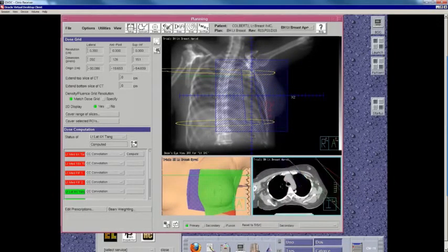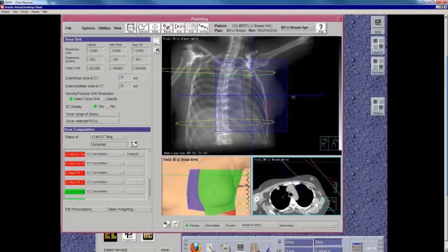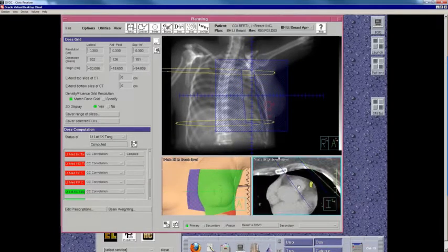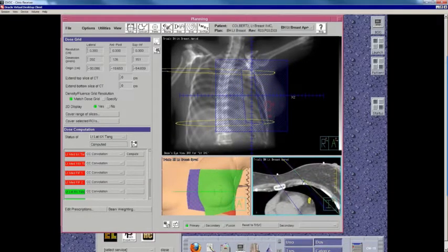If you have a bigger hinge angle, say of 15 or 20 degrees, you're going to have a cold spot that's too cold. So here's my cold triangle right here, which is the triangle created by the differences in divergence in these two fields. If we have a 15 or 20 degree hinge angle, then this cold triangle gets too big. If we have a 0 degree hinge angle, then basically these fields overlap and you end up with a big hot spot in the breast. So 10 degree hinge angle seems to be a sweet spot.